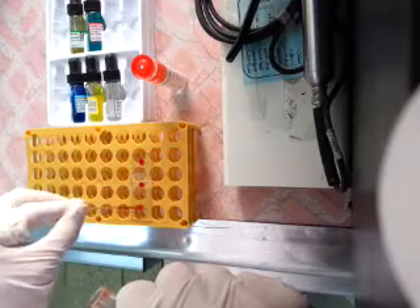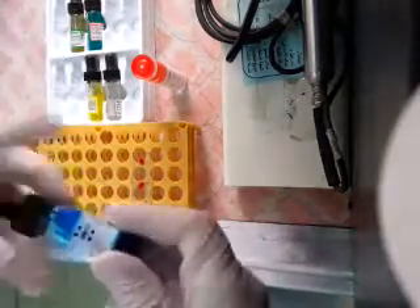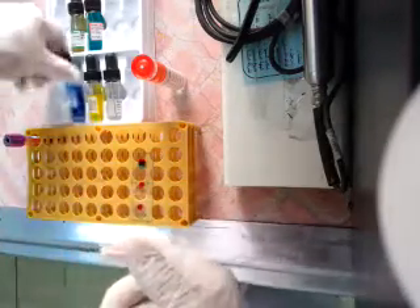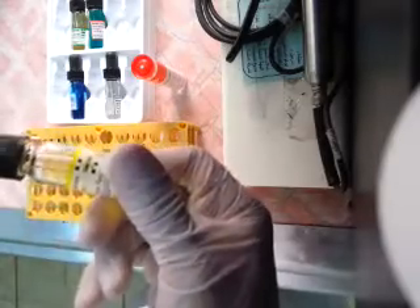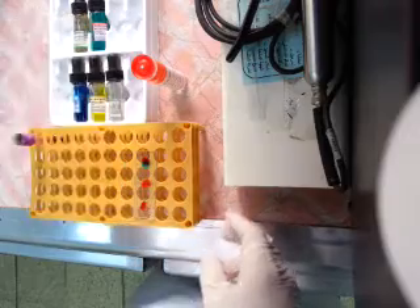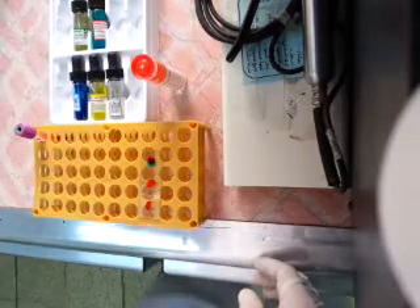Positive or negative. We will add a drop of anti-A and one drop of anti-B, and we will see agglutination. When we see agglutination, this will confirm the test.